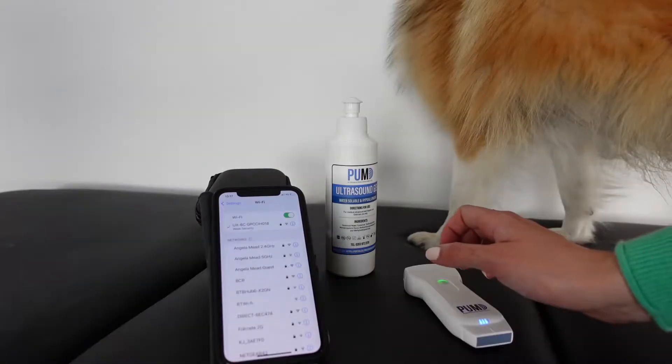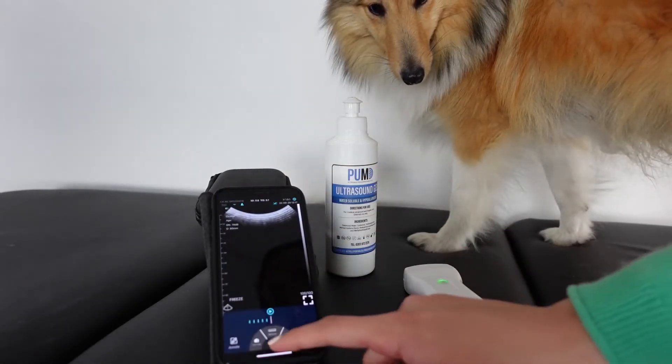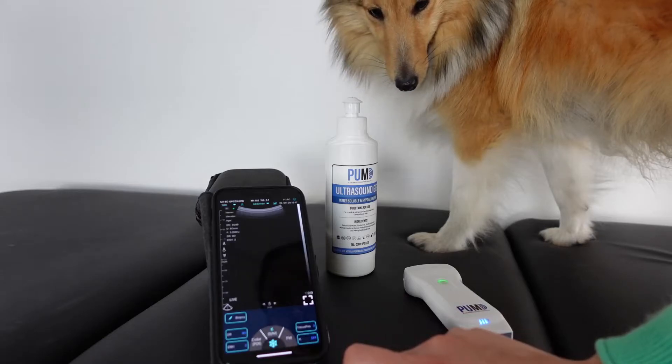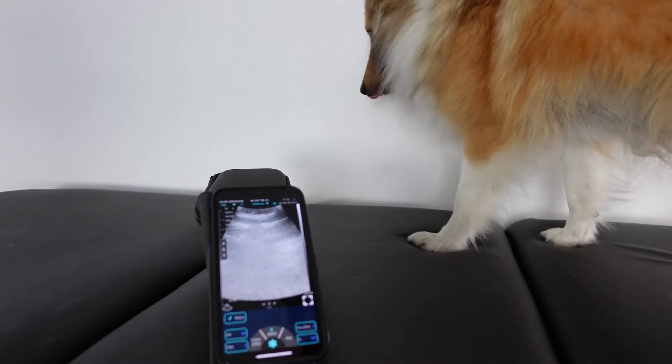The Pulse Echo Duo is 128 elements. It's double the price, but it has additional features like tissue harmonic imaging, colour Doppler and power Doppler, and a smaller footprint as well, which makes it much better for small animal scanning.